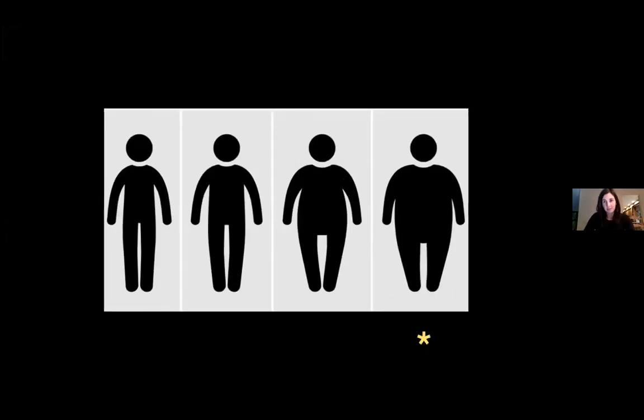However, the reality is a little bit different. Most of our patients are actually on the other side of the spectrum, a little bit more towards the right of the screen, where the linear probe is definitely not going to work. You're not going to see anything, you're just going to see the abdominal wall muscles, and that's going to be it. So when you're looking for an appendix, use it in people that you think you might be able to find it in, those with a lower BMI. Those who have a lot of subcutaneous or adipose tissue, don't lose your time there. You can try to find an alternate cause, but it's not the time to get your linear probe and really fish for that appendix. Just a word of caution.